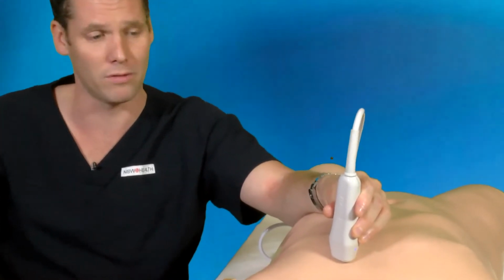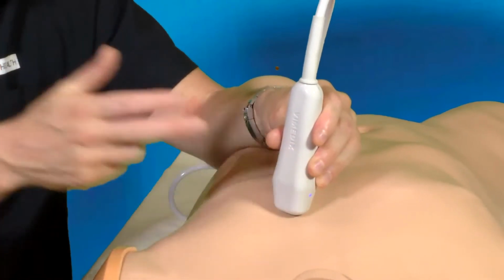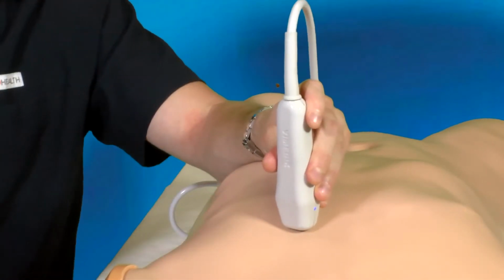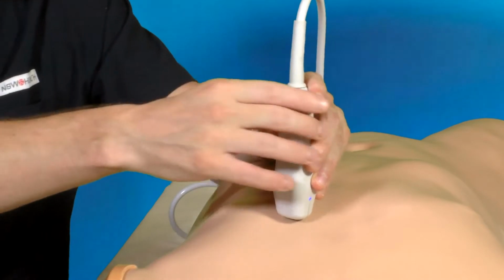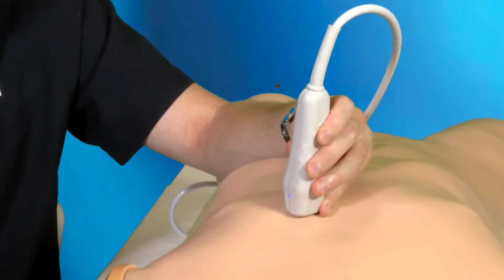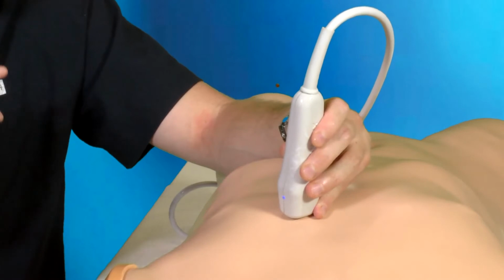So we will be imaging in 3 main areas. We have our parasternal long axis view, which is going to be in about the 3rd, 4th intercostal space right next door to the sternal border. We use that for our parasternal long axis, where the imaging dot on the probe points towards the patient's right shoulder. That's how to get the parasternal long axis view. Then we are going to rotate 90 degrees with the dot pointing towards the patient's left shoulder, and that's going to give us our parasternal short axis view, where the heart looks like a donut.